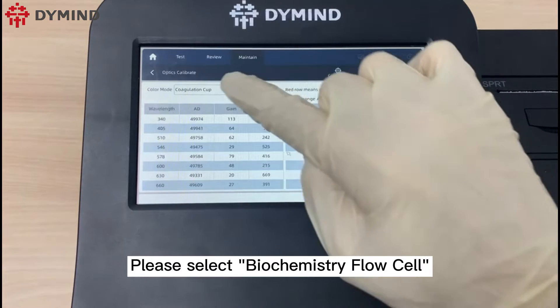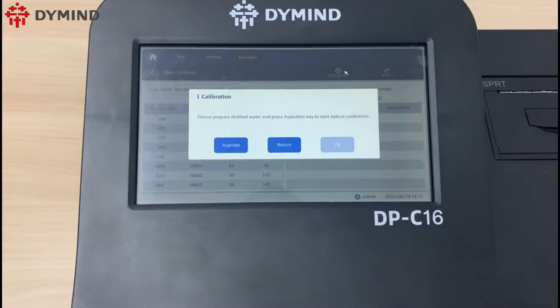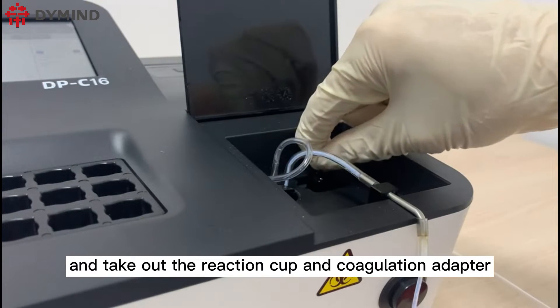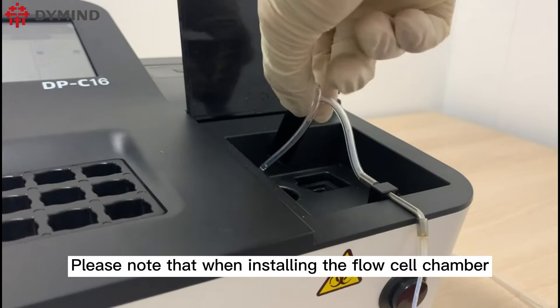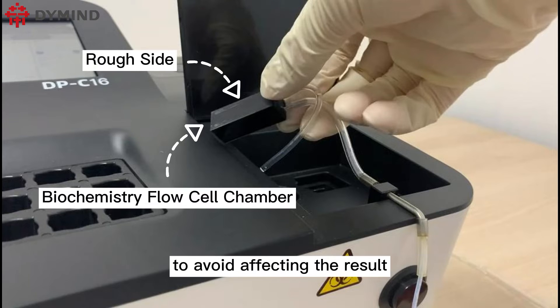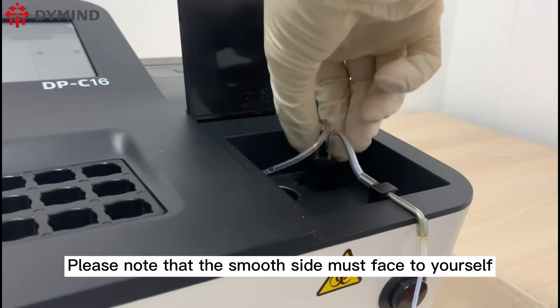Please select biochemistry flow cell, then click calibration. Open the cover and take out the reaction cup and coagulation adapter. Please note that when installing the flow cell chamber, the finger can only touch the rough side of the chamber to avoid affecting the result. Please note that the smooth side must face toward yourself.